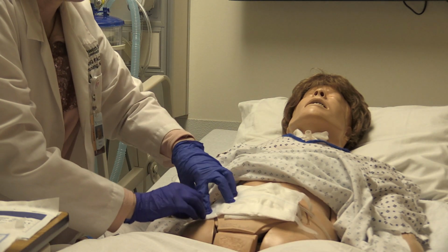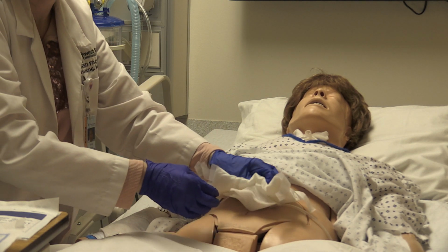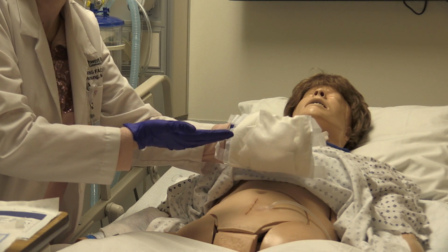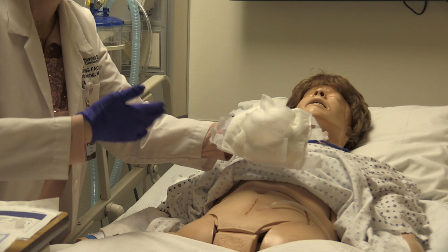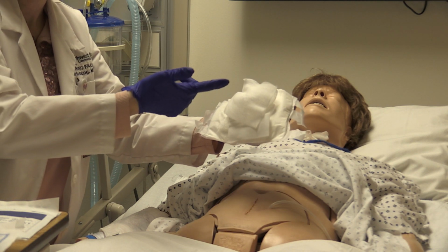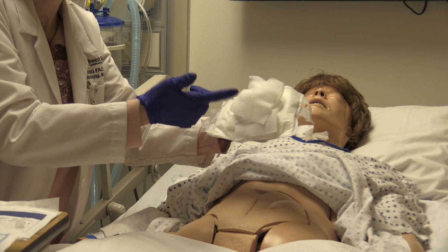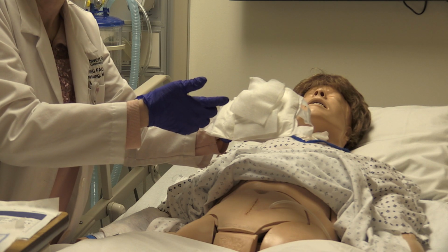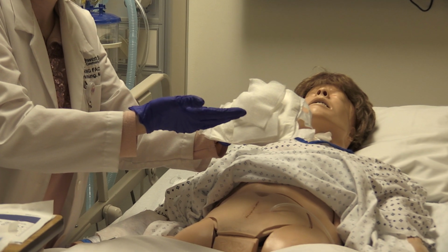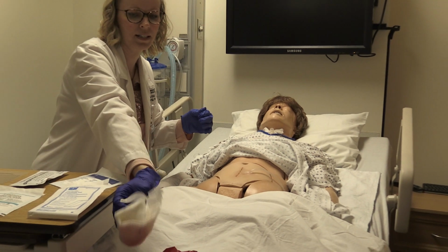And it's also a really good idea, when you remove the actual dressing, to move it away from the patient's point of view, so that if it's really nasty and yucky, he won't be seeing that, or she won't. And so you want to note the old dressing or the old drainage on here. Is there a large amount, small amount, moderate amount, quarter size? What color is it? Is it thick, thin? And is there any kind of odor to it? So we're going to go ahead and fold that up and discard that.